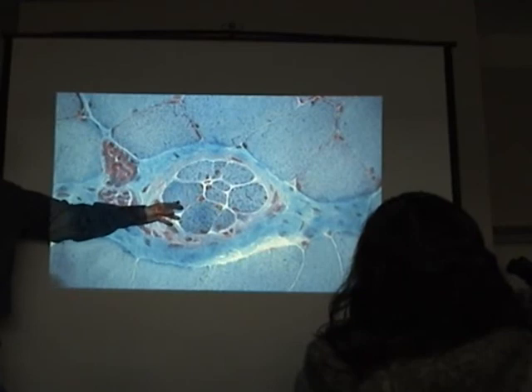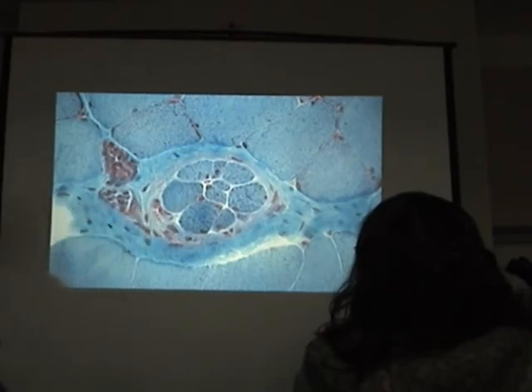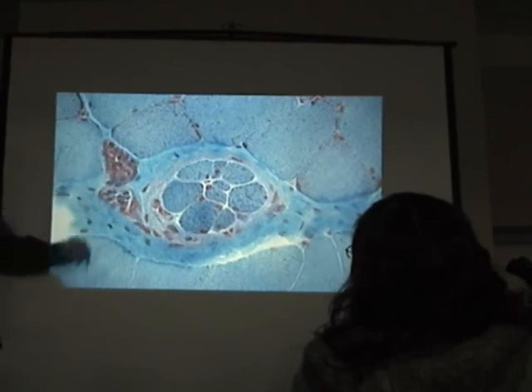There are two types there, you don't have to know that. And two types of afferent or sensory structures that go to the dorsal horn, and you form a monosynaptic reflex arc with a motor neuron, right? So it's like the patellar, well, it's not quite patellar because that's a Golgi tendon thing, but it's the same sort of thing as a reflex, all right? And this actually, in a Gomori trichrome, is a nerve.